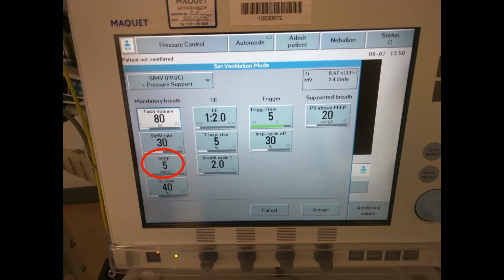What you're trying to do is have the lungs optimally inflated, and to do that you need to use whatever PEEP is the right amount of PEEP for those lungs, not just because you've been taught some silly rule that high PEEP is dangerous. If you need a high PEEP to hold those lungs open at a normal level of inflation, then that's what you need to do.